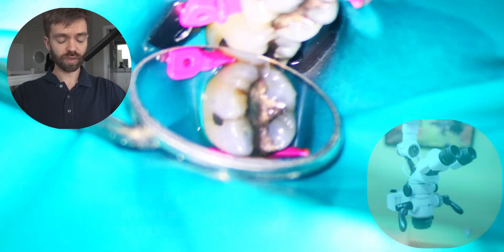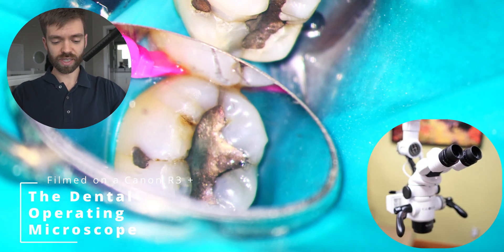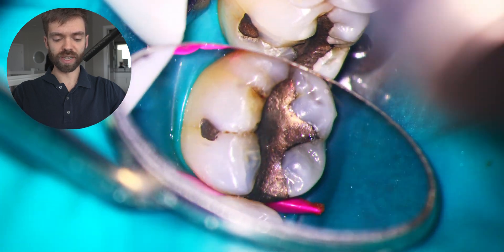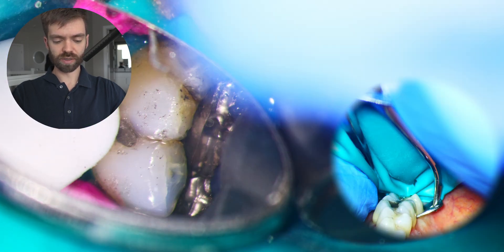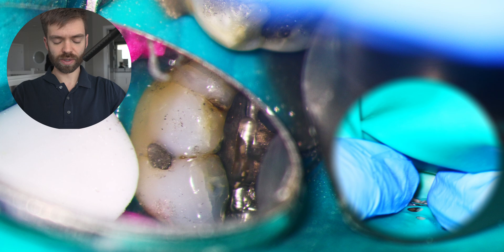We're removing a silver filling here, and the first thing you'll see is the green sheet. That is a rubber dam that's going to keep the little bits of silver filling from getting down the hatch.